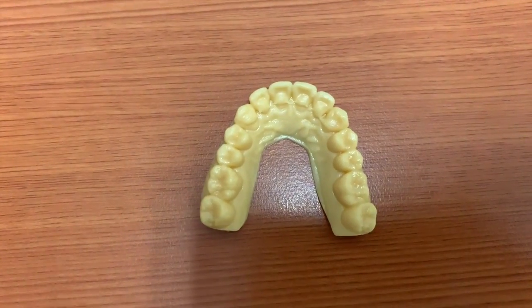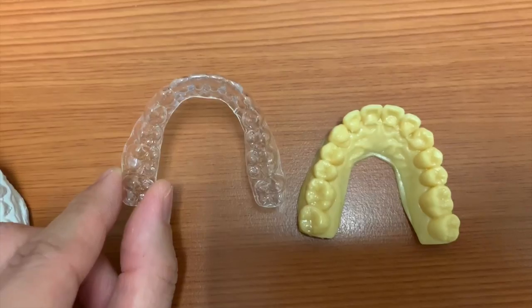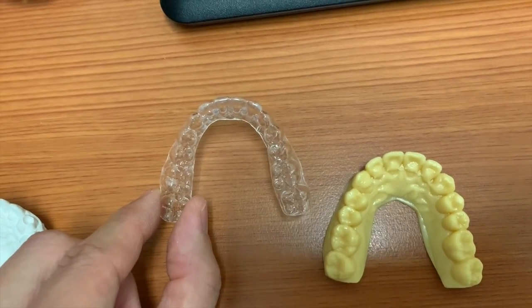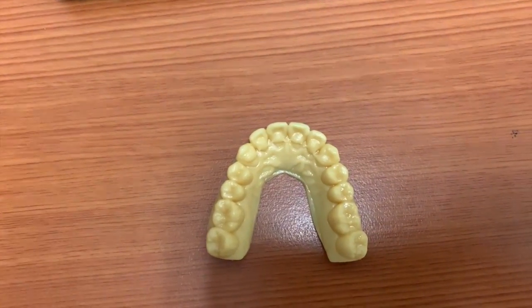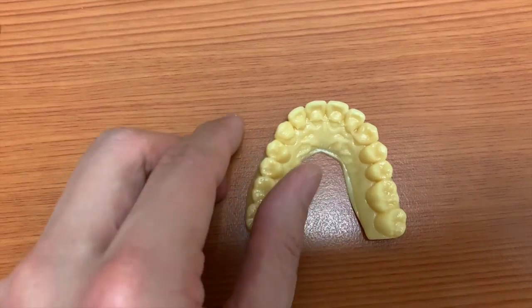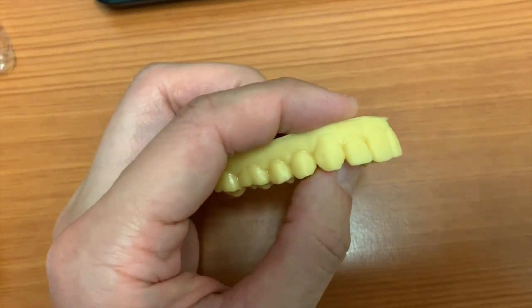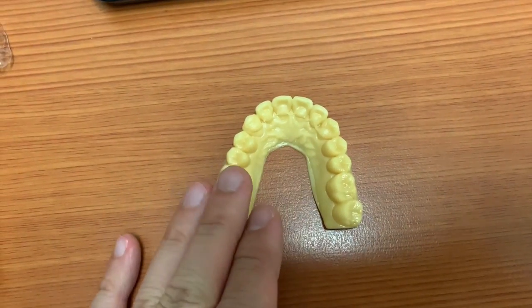These are retainers designed to keep your teeth straight. These retainers are generally worn initially day and night time, and then after a short period of time you go to night time only. Nowadays, instead of a mold, we actually do a scan of your teeth. If you look here at the scans, you see it represents the teeth quite well. There are no bumps on the teeth, and it's all very clear.